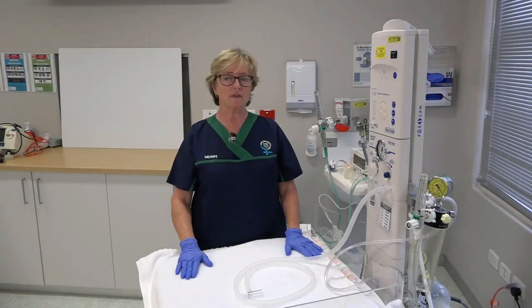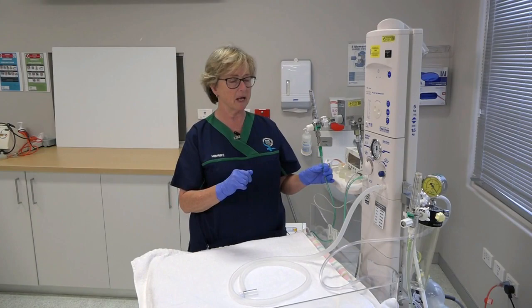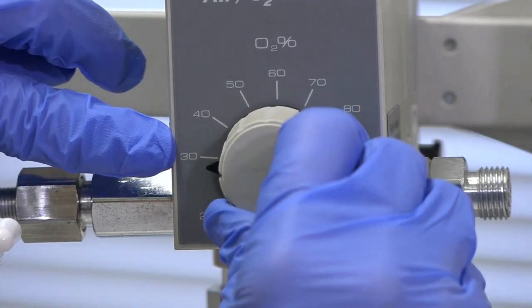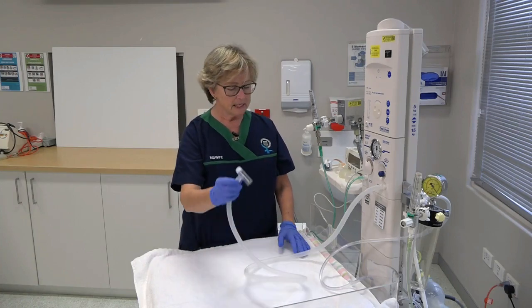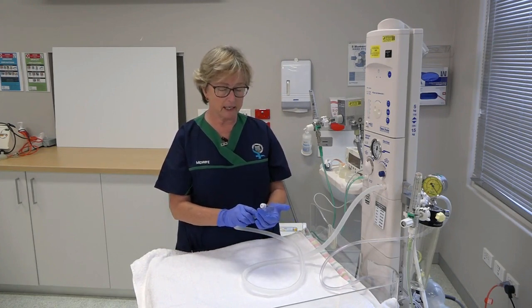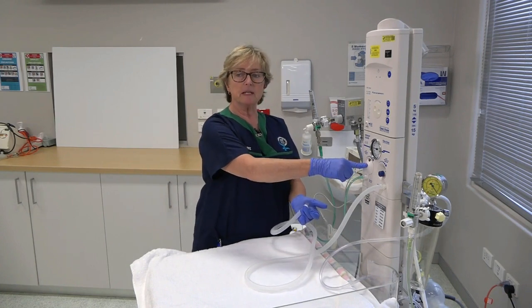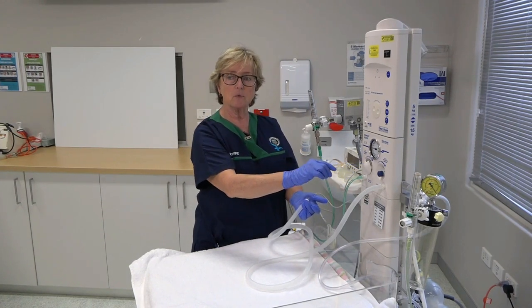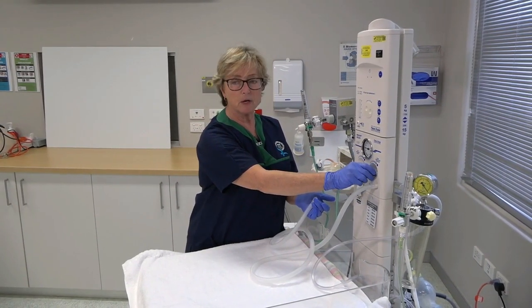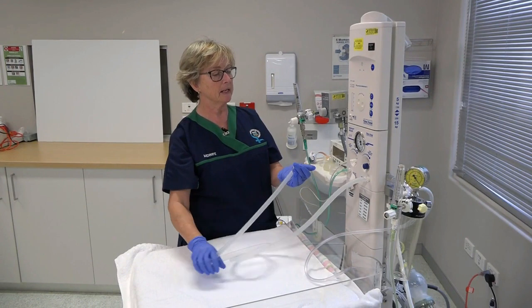The video will demonstrate the checking of the Neopuff T-piece ventilator. The T-piece is gas dependent, so we will need to turn the gas supply on. We will turn it up to a flow of 8 litres and commence on 30% oxygen. The next step is to check that our top and bottom pressures are correct. Initially, we are going to occlude both openings of the T-piece with our hand. The maximum pressure relief prevents use of excessive pressures when ventilating the neonate. Turn the peak inspiratory pressure, or PIP, dial clockwise to its maximum.